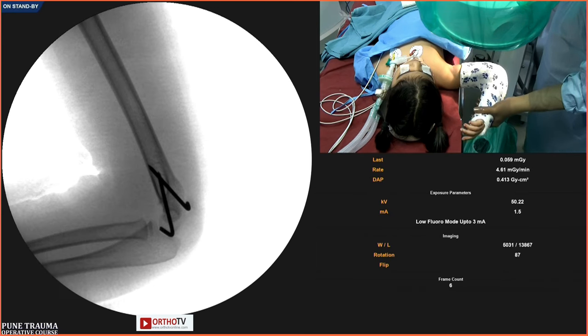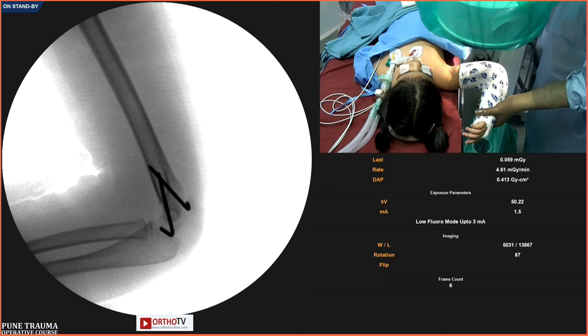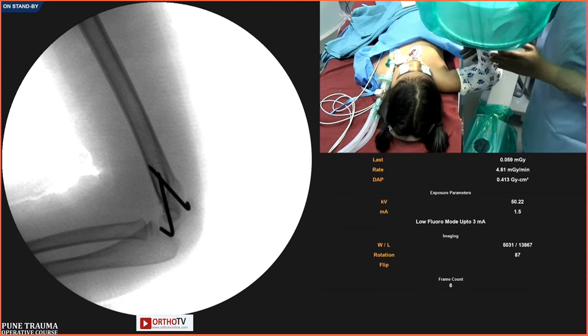Taral, you are okay with the lateral? Yeah. Okay, teardrop looks good, lateral is good. And now I am rotating it. So now we have the arm rotating after the pinning is done. Perfect. Absolutely excellent. It is excellent, Sandeep.